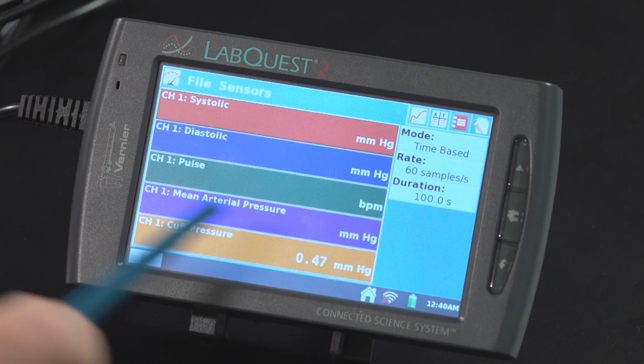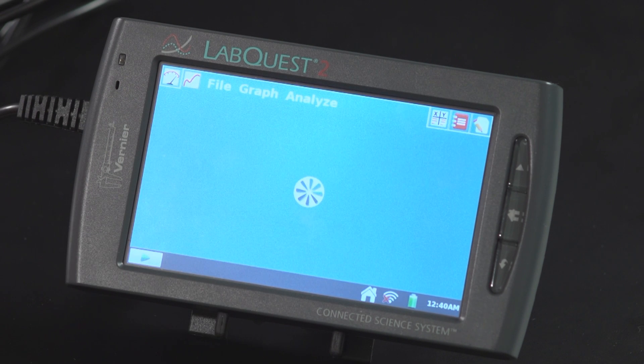What I'm going to do next is begin data collection by tapping on the start button. Then I'm going to pump the blood pressure cuff up to just over 150, and then I'm just going to let it go, and the LabQuest 2 will calculate the blood pressure parameters. So I'm going to tap on this collect button, and then I will pump up the blood pressure cuff, and then I'm just going to gently let it down and sit quietly for about 100 seconds until the LabQuest 2 finishes collecting data. I'm going to pump this up now.